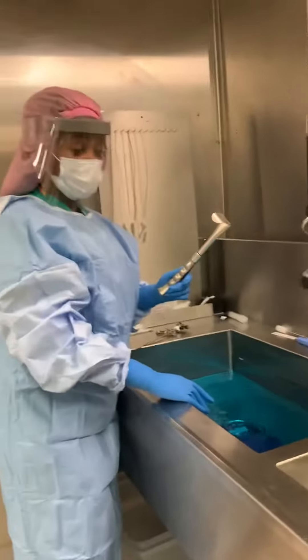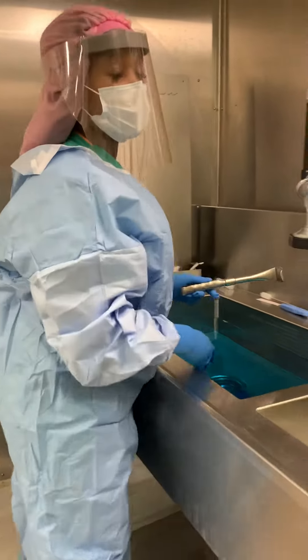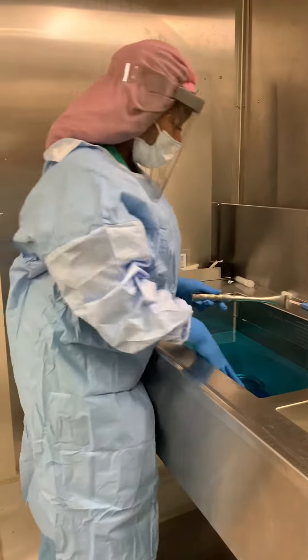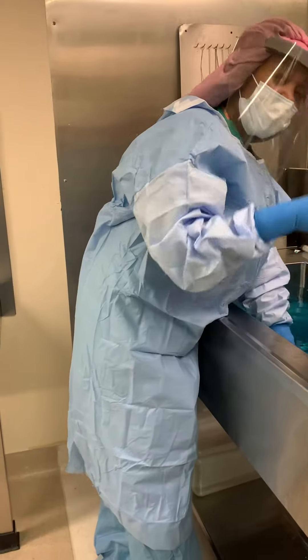When you drop it on the floor, you come in — make sure that you have your water ready and your solution. It's going to be a half an ounce to every gallon, and just put it in the water.